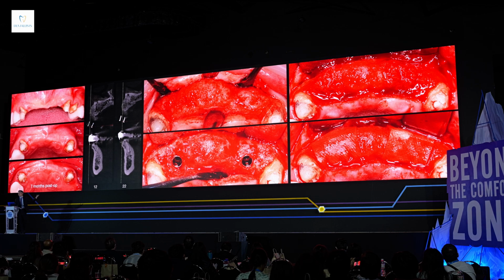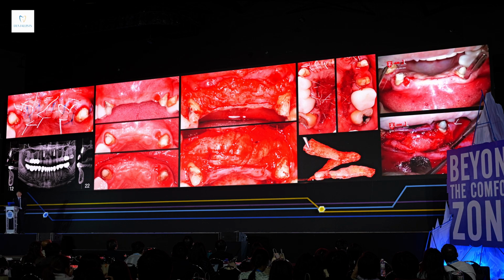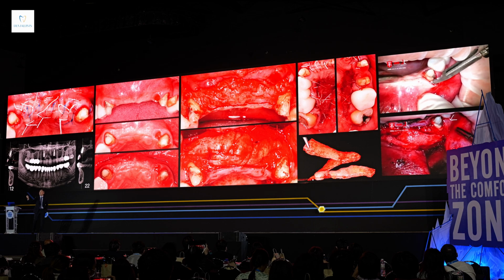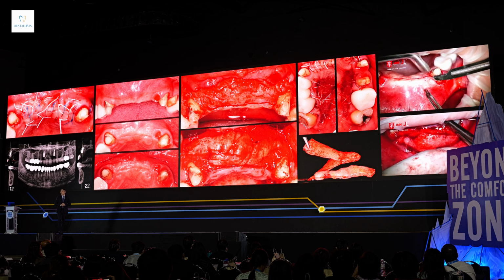If you look at the bone, right, we have enough bone for implant placement and to place the implant at the correct position. So I place the implant on the laterals and they healed up. Then what should we do? Remember, in order to close up the wound, I moved the tissue all the way up. So I kind of moved the mucogingival junction.